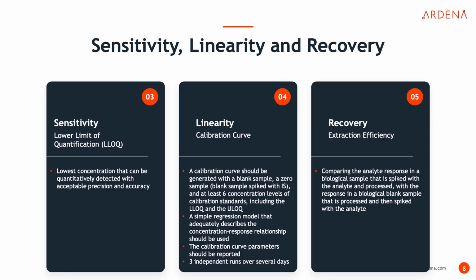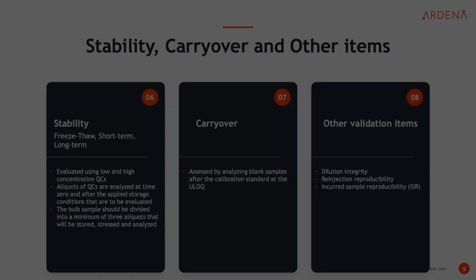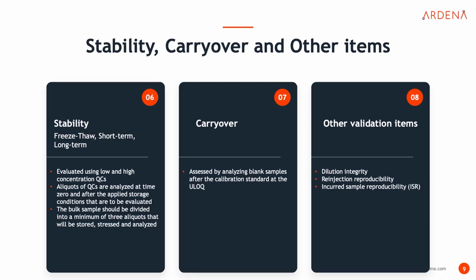And in the end, the validation should be run over several days, as was already mentioned at the precision and accuracy. It should be on different days, at least 3 different days. The extraction recovery should also be evaluated, and furthermore, on the next slide we should also focus on the validation part on the stability.